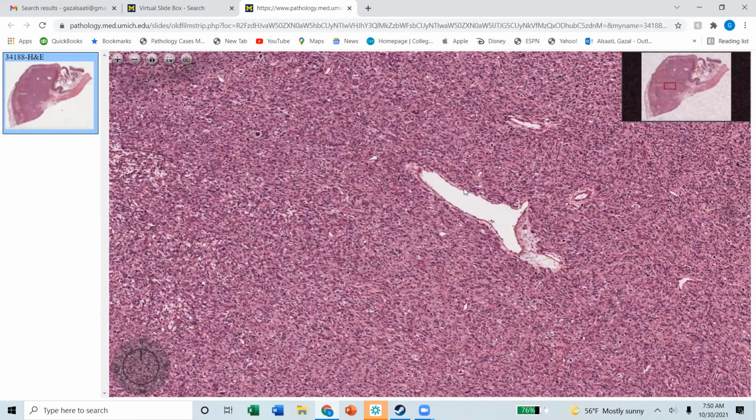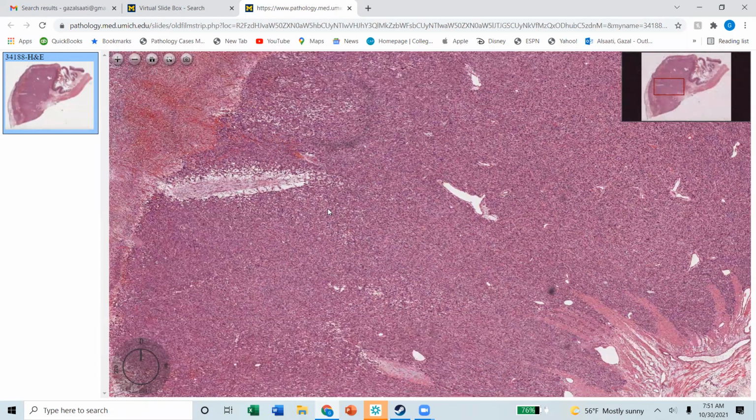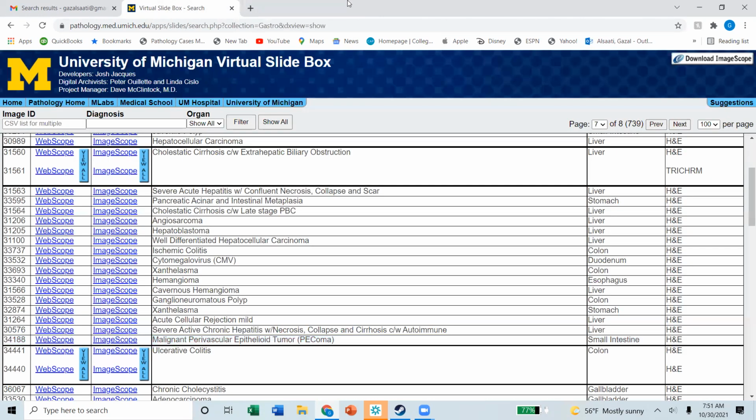I think it's the melanoma stains, HMB-45 and S100, right? Great. For me, it's going to be a lot of reading before making this diagnosis. We'll be having a soft tissue expert here as well.